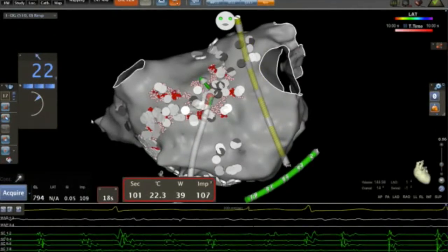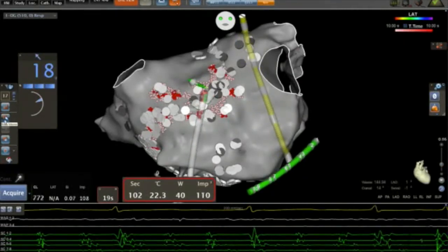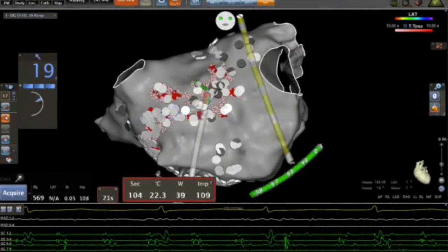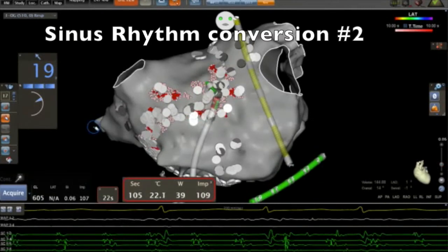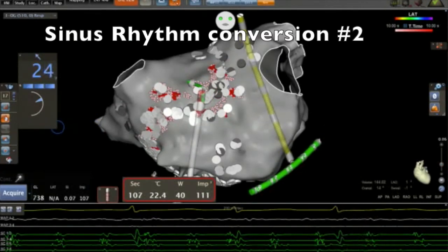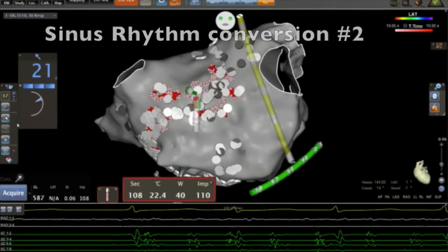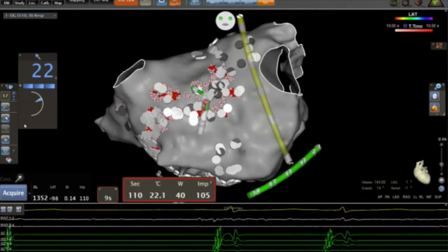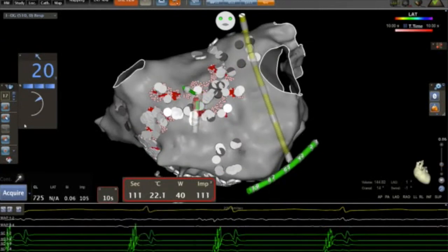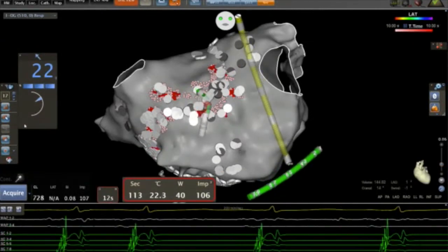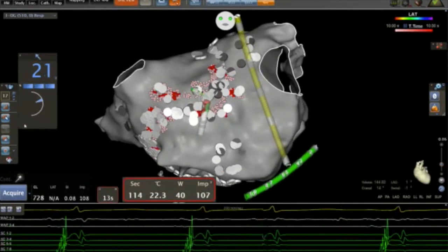As you can see here, by ablating the dispersion region on the entire wall, we terminate AFib directly into sinus rhythm. Then we continue to ablate the whole surface of this dispersion region.